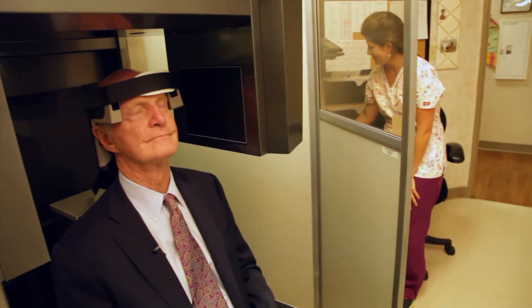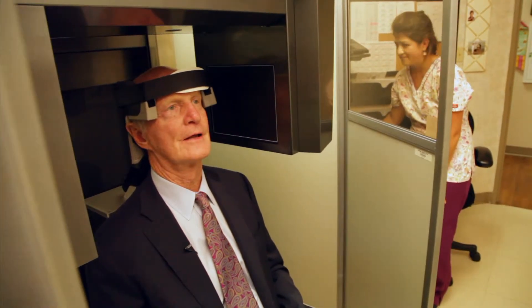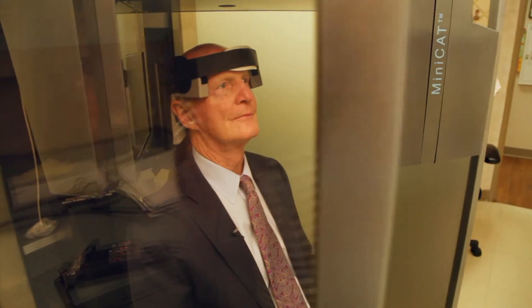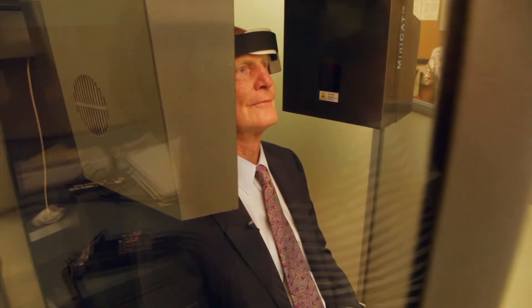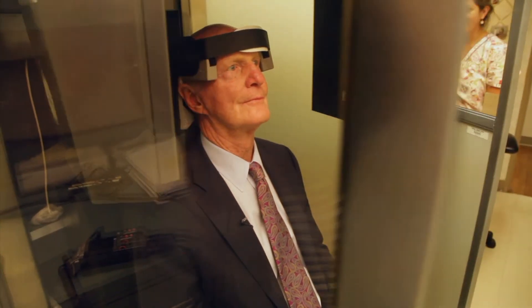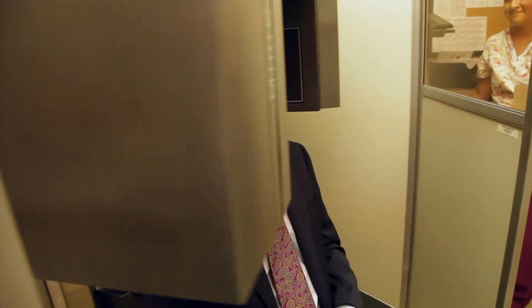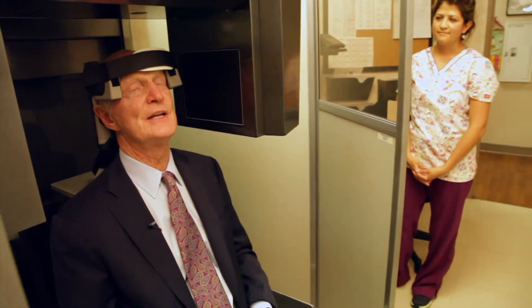That'll be hard for Dr. Bob. I didn't feel a thing, and the CT scan of the sinus has been done.